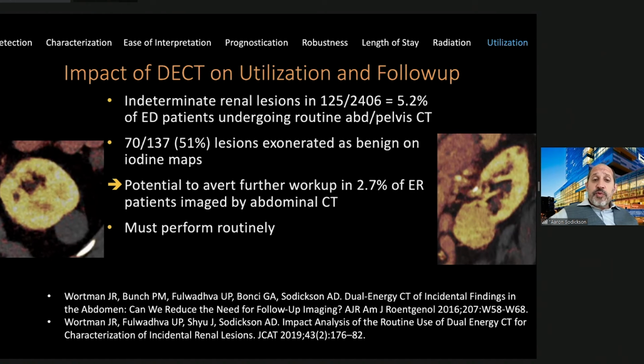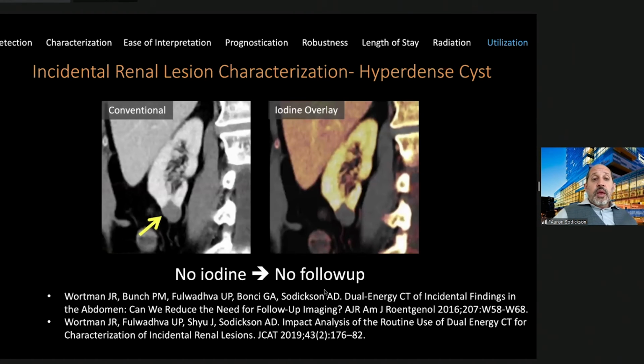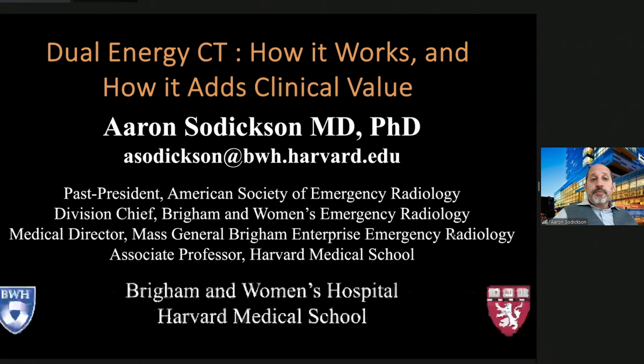To do this, we have to perform dual energy routinely, which we do on all belly CTs. And if we do that, we can really reduce patient anxiety, resource allocation, cost, and radiation exposure. So the bottom line here is if we see one of these lesions, we have no iodine on our overlay images, we do not recommend follow-up.